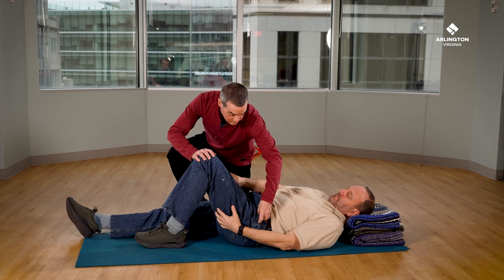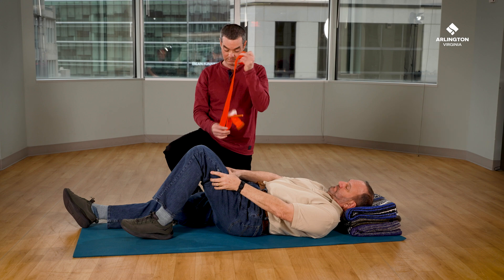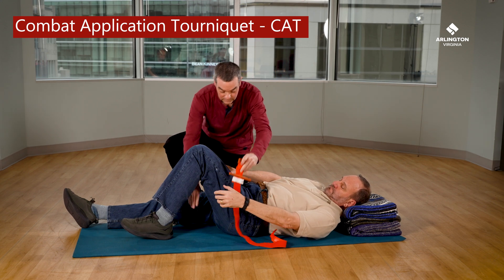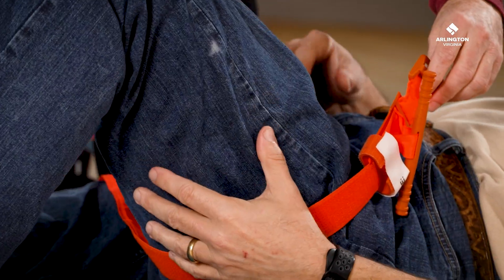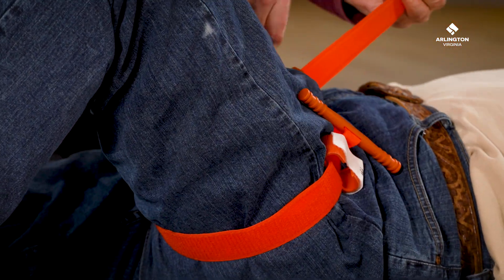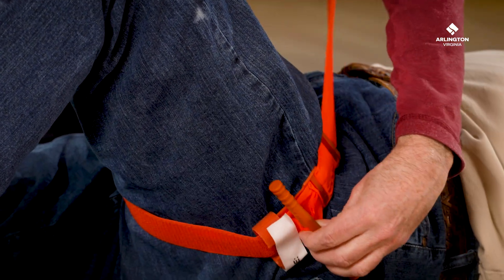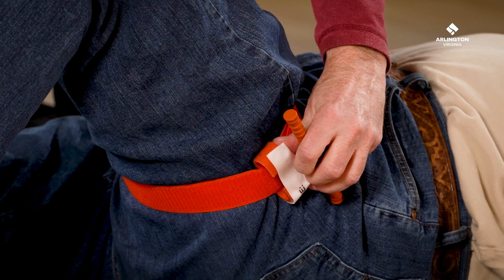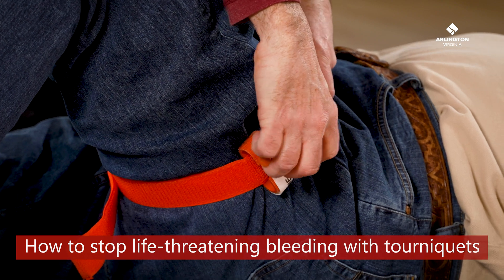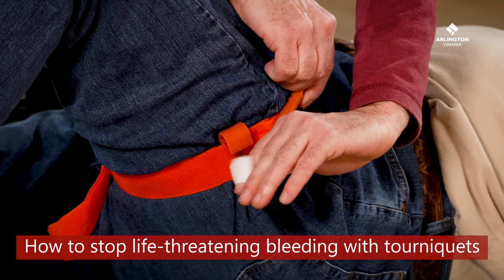If placing a tourniquet on a leg, empty pants pockets first to remove any obstacles. This tourniquet is called a Combat Application Tourniquet and does not make a click. If you have this tourniquet, which is more common, you must still pull the strap as tight as possible before turning. It should be tight enough that you can't put two fingers underneath. Twist until you can't possibly twist anymore — it may be painful but it will stop the bleeding. Remember, always place it high because you may not be able to see all the injuries, and it's better to shut off all the blood flow to the limb.